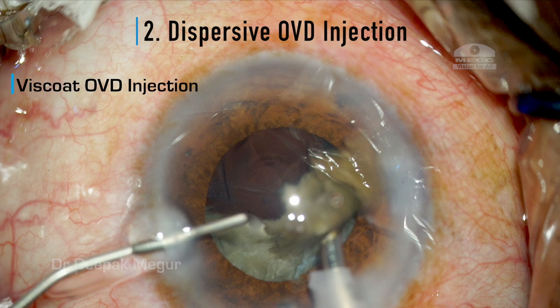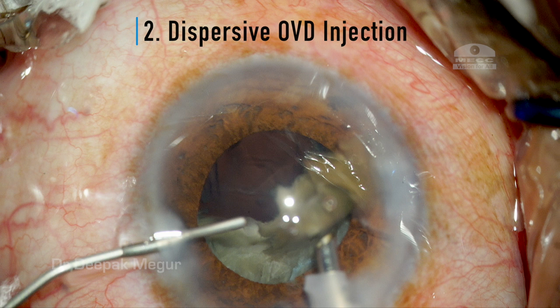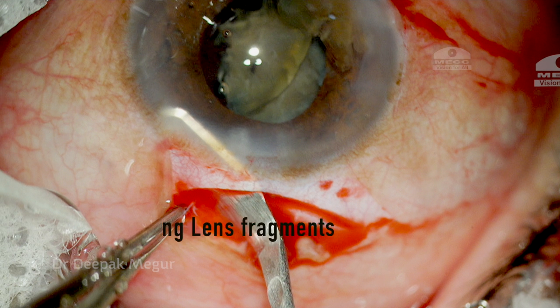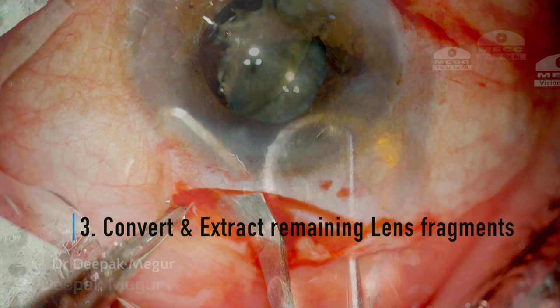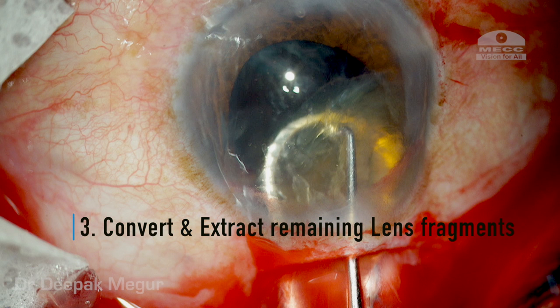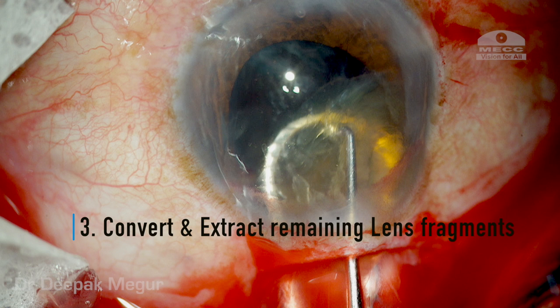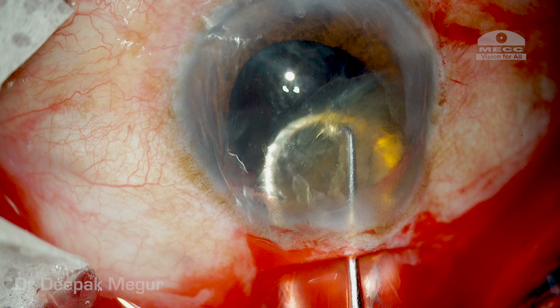Denial is the commonest mistake, which invariably proves expensive. Rule two: once the PC tear diagnosis is made, inject dispersive OVD under the nuclear fragments — this will provide tamponade and prevent fragments from dropping into the vitreous. Rule three: in the presence of significant nucleus in an eye with a large central PC tear, it is always wise to convert to SICS and extract the remaining fragments manually. This single step most often prevents nucleus drop and also protects the rhexis while minimizing corneal endothelial damage.